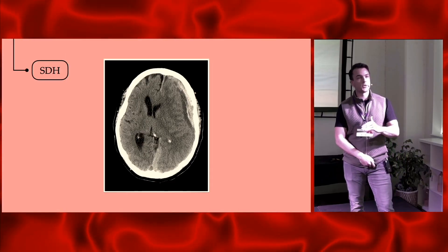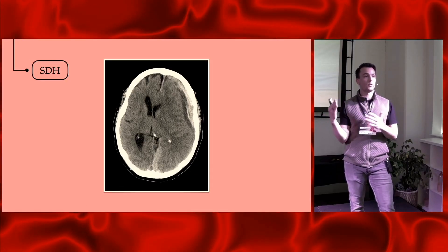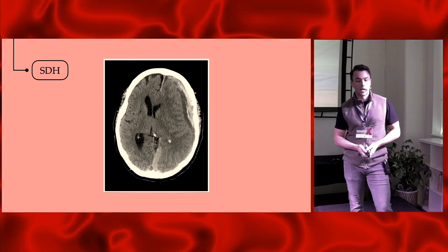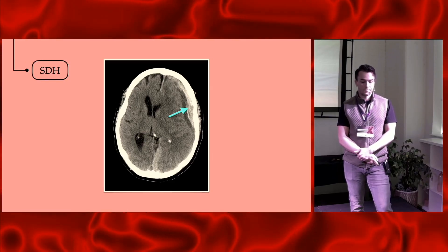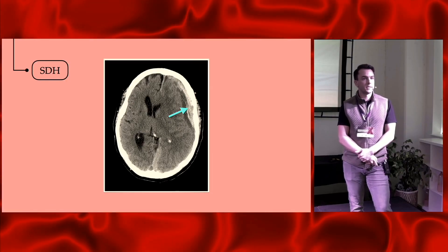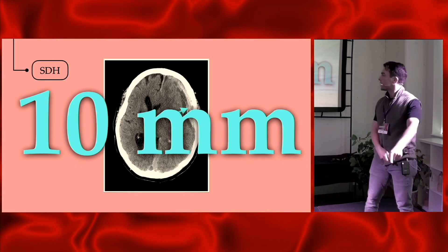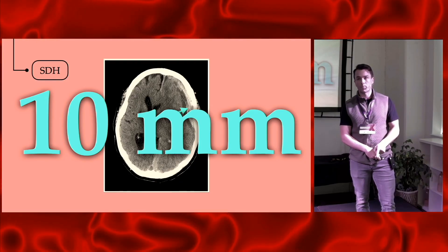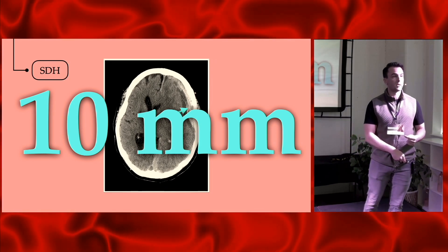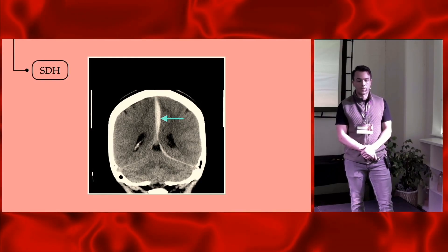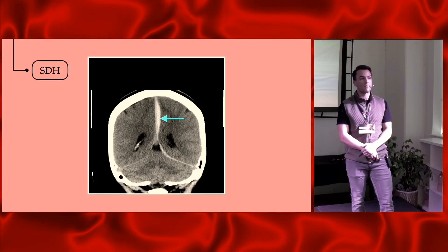Subdural hematoma occurs when there's an insult to the bridging veins underneath the dura mater. As we age, the gap between the dura and brain expands, so older patients who fall often get subdurals. On this CT cut there's a lot going on — here's the subdural, but also significant midline shift. The key number here is 10 millimeters: according to the Brain Trauma Foundation, that is the threshold at which neurosurgical intervention is needed. Also note: a parafalcine subdural hematoma can be isolated to just that area — make sure you're looking at all the dura when searching for subdurals.